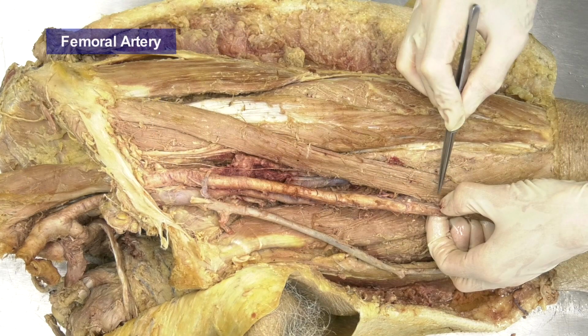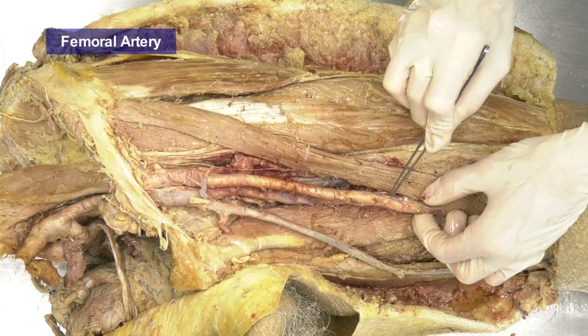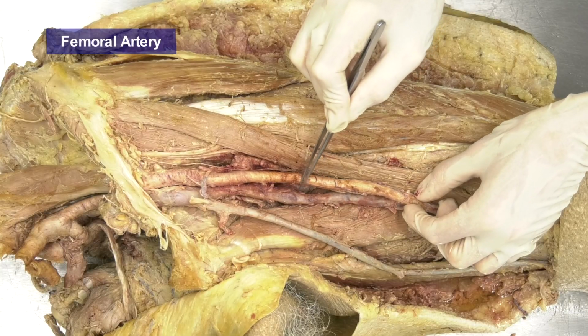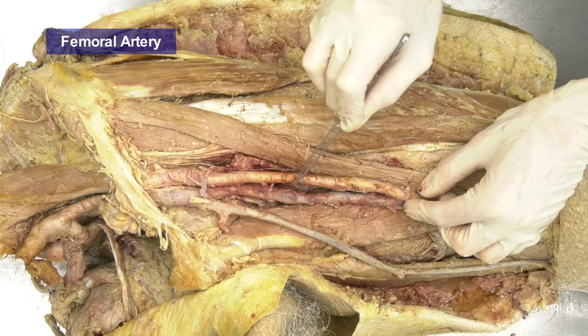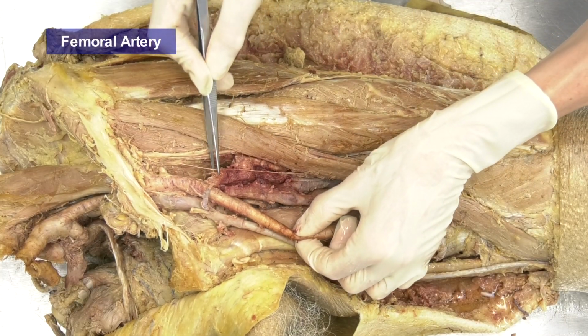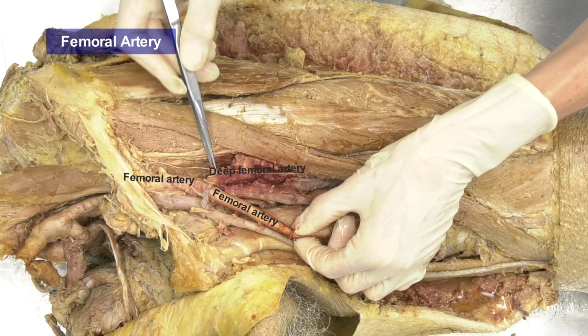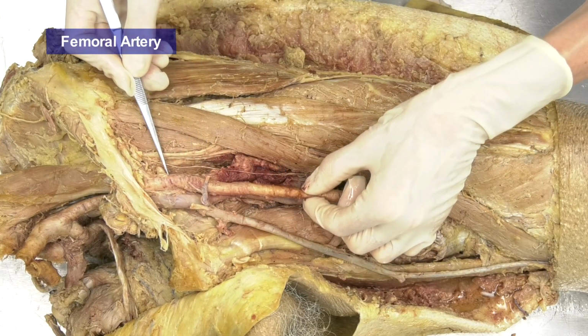Now let's move on to the femoral artery. Examining it at the distal end of the triangle, we see that the femoral artery moves from a ventral to a lateral position to the femoral vein, where it is joined by the deep femoral artery, which together then enter the vascular lacuna as common femoral artery.